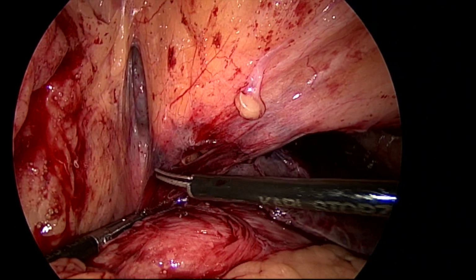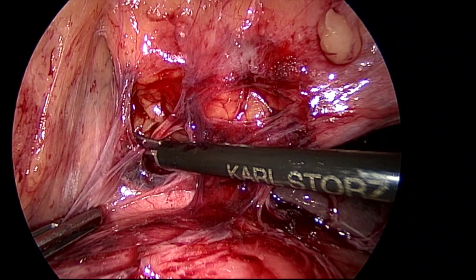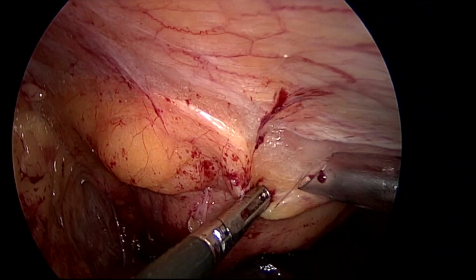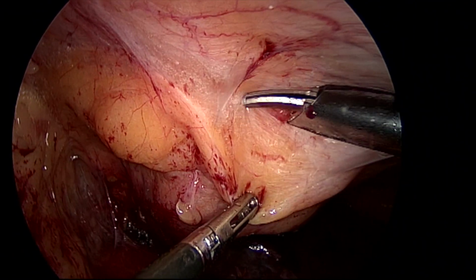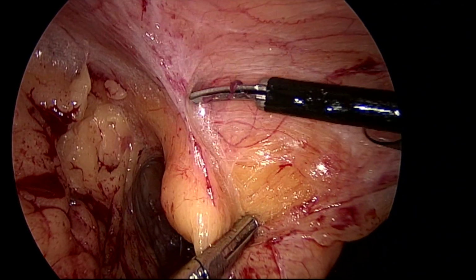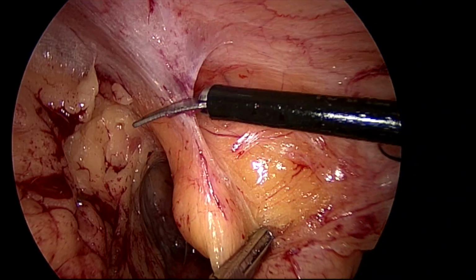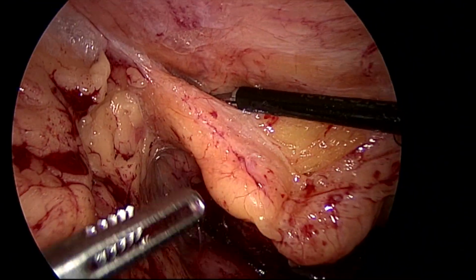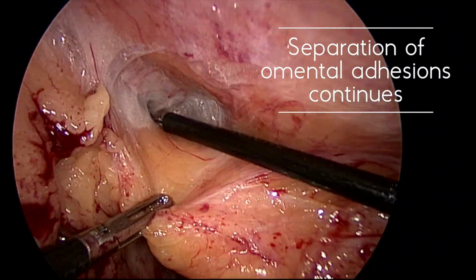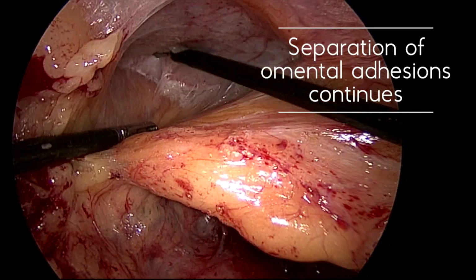I'm finding it difficult to reach the gallbladder region because of the lot of adhesions, and the patient was treated with antibiotics, and multi-organ failure was there, deranged liver function, and renal function is deranged. So the patient was treated outside and then referred here. So I'm separating the omental adhesions, and we stabilize the patient, and then we are taking it for laparoscopic cholecystectomy.